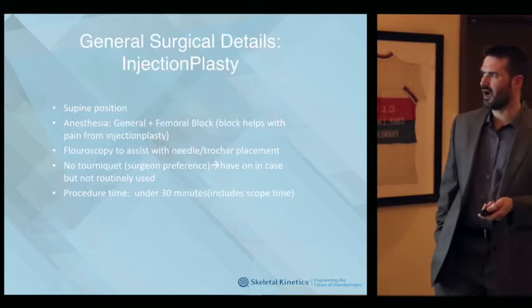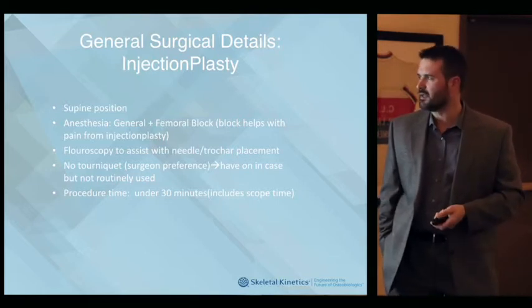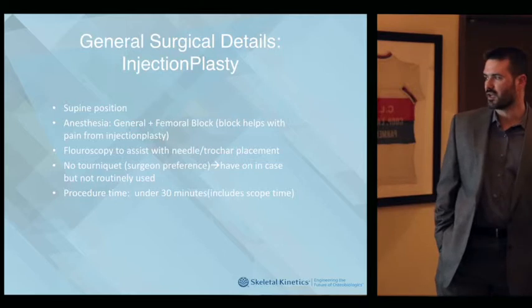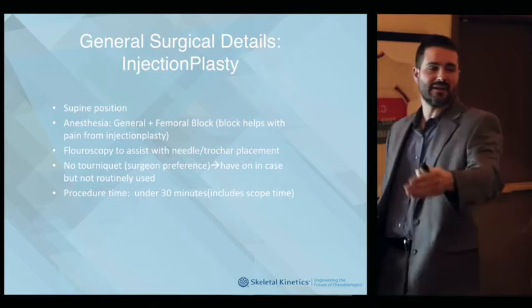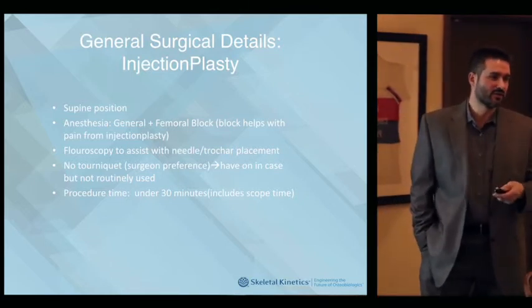I do the supine. Sometimes I'll do a block, sometimes I don't. It does help with the pain. I always use fluoroscopy. You don't have to use a tourniquet. And really, the injection part, I'm adding knee scope plus injection, that's including the mixing on the back table, everything, 30 minutes or less. If I didn't scope the knee, literally 5 minutes.